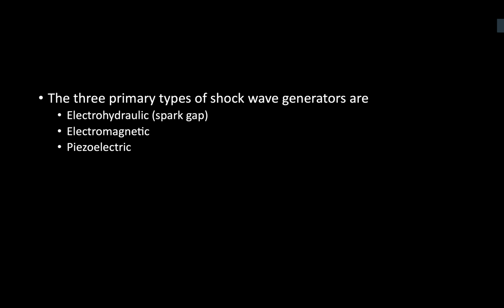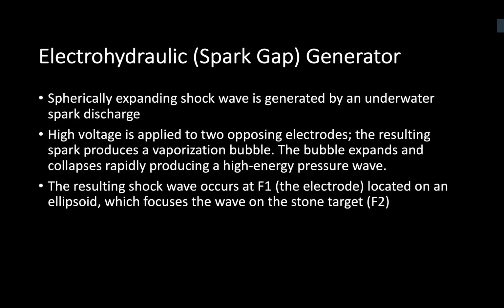Okay. What are the types of shockwave generators you are aware of? I'm aware of the electrohydraulic lithotripter, piezoelectric, and the electromagnetic. What type of lithotripter is used in your department? It's the electromagnetic that is used in my own department. Okay. How does an electrohydraulic generator work?